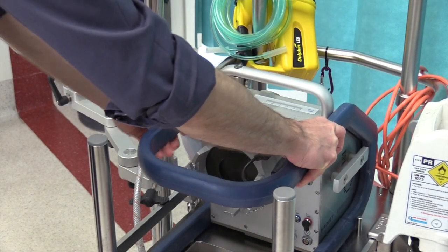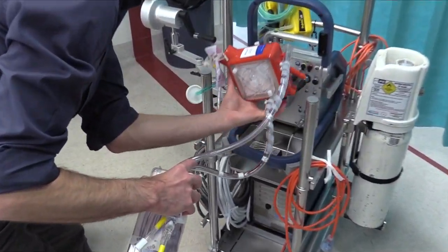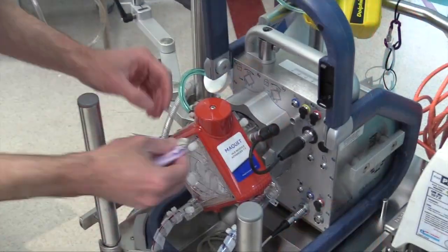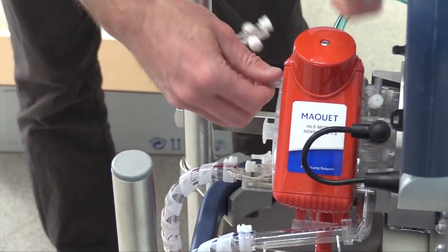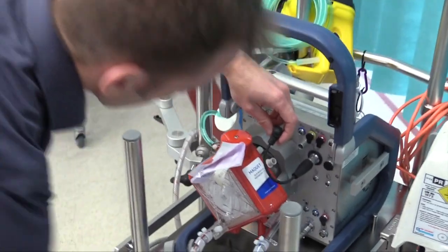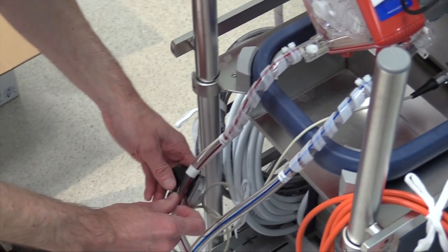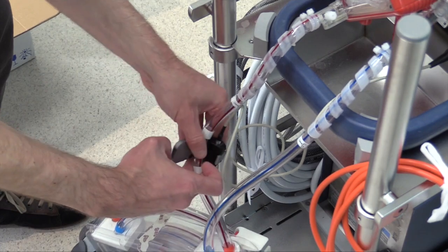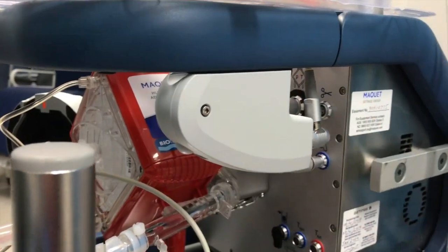First, place the cardio help arm in the up position and connect the red combined pump oxygenator module to the cardio help. Place the de-airing port or yellow cap off. Add the three-way taps with extension tubing to the pre and post oxygenator ports. Connect the integrated sensor cable, which measures temperature and pressure, to the HLS module. Connect the flow probe — which is also a bubble sensor — to the return line, ensuring the direction of flow is correct. Ensure the venous probe is connected to the initializing station on the blue handle.